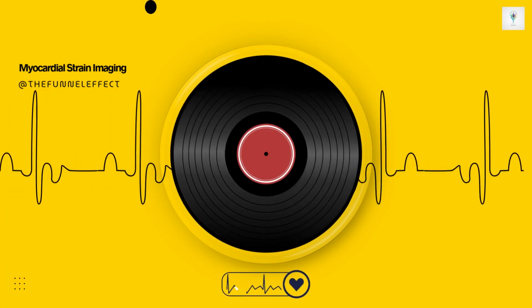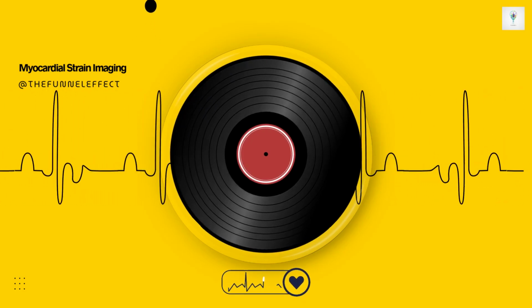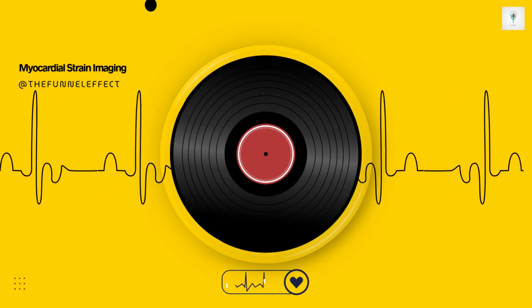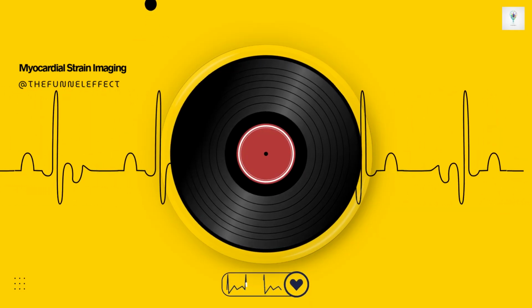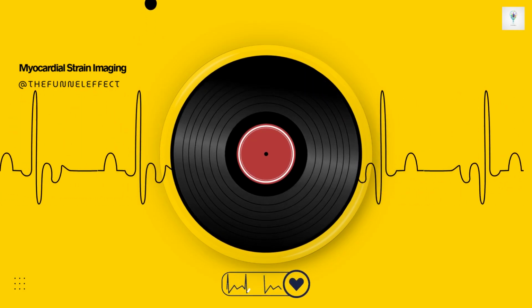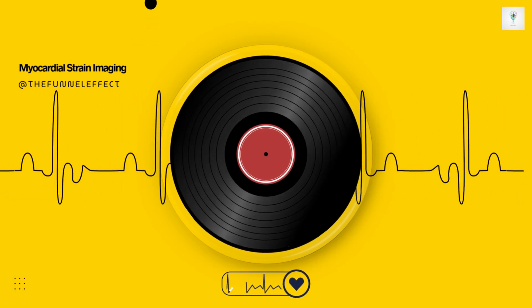The source had a really striking ratio here about how different contractions contribute to volume. Yeah, this is often the real aha moment for people used to thinking purely in terms of EF. The left ventricle isn't a perfect sphere. It's more like an ellipsoid, longer than it is wide. And simulations have shown something fascinating. Which is? That the circumferential contraction, the squeezing motion around the short axis, like tightening that belt, has a massive, disproportionate impact on the calculation of stroke volume and therefore EF.